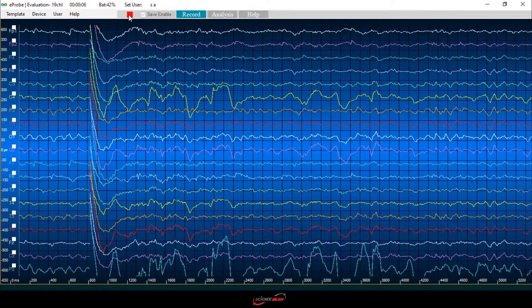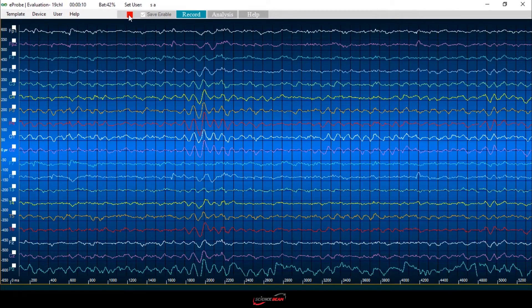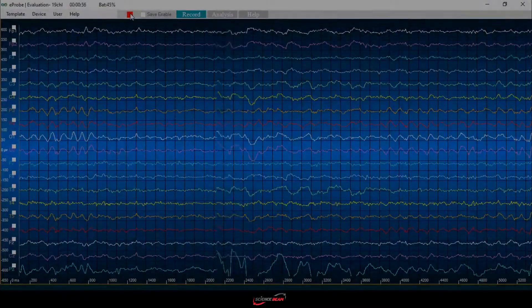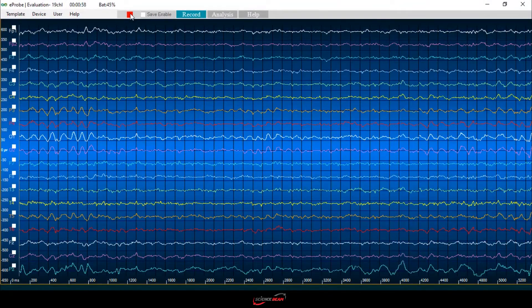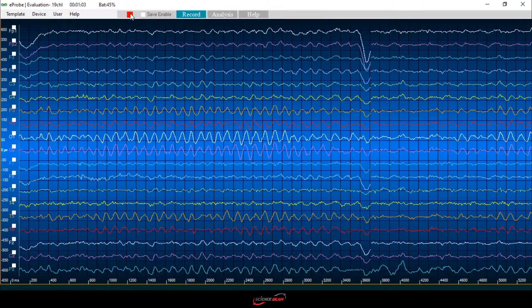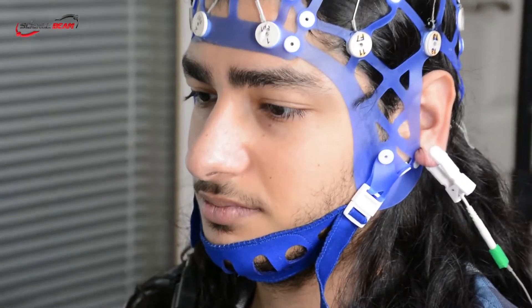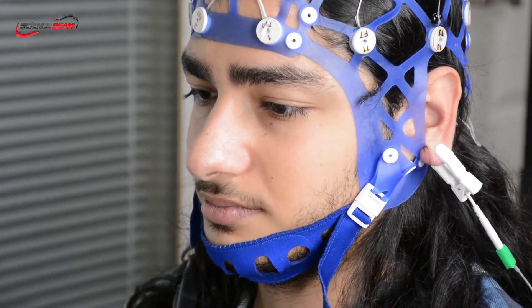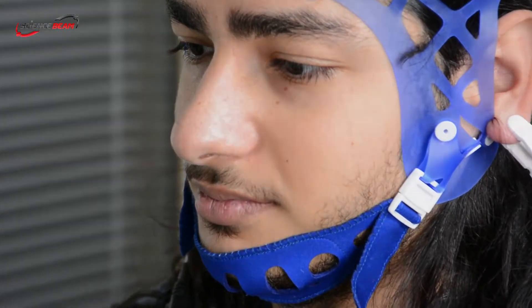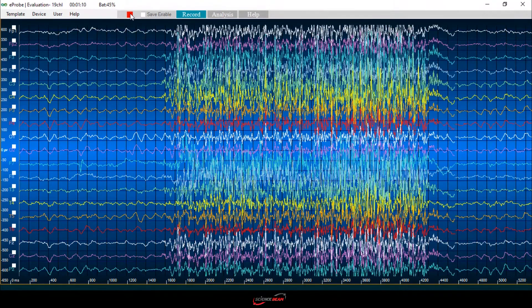Now we are going to do some tests to assess the brainwaves. Ask your client to close his eyes. As you can see, alpha wave is observed in some recording channels. Ask your client to press his teeth. Now you are observing EMG mixed with EEG, which is one of the most common artifacts.